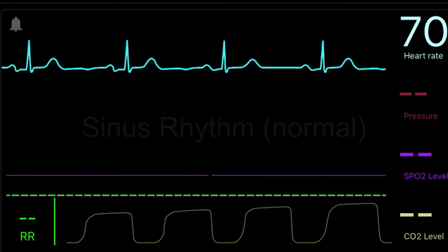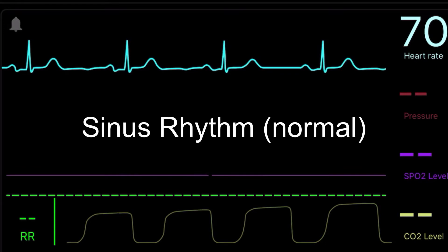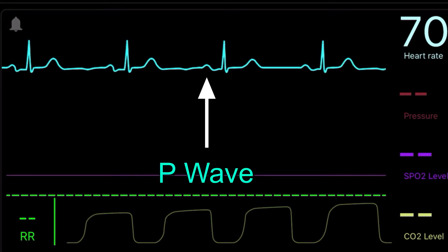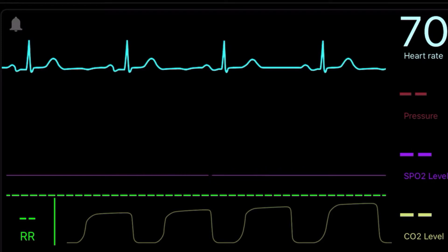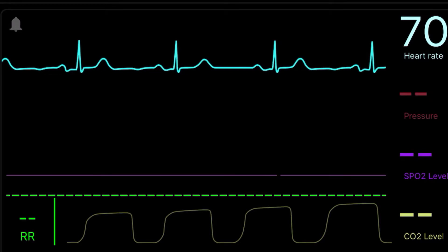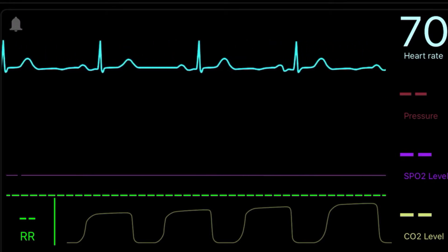This is a normal sinus rhythm. You can see there is a P wave, a QRS complex, and a T wave. The P wave is when the atria are contracting, the QRS is when the ventricles are contracting, and the T wave is when the ventricles are returning back to their normal resting state.